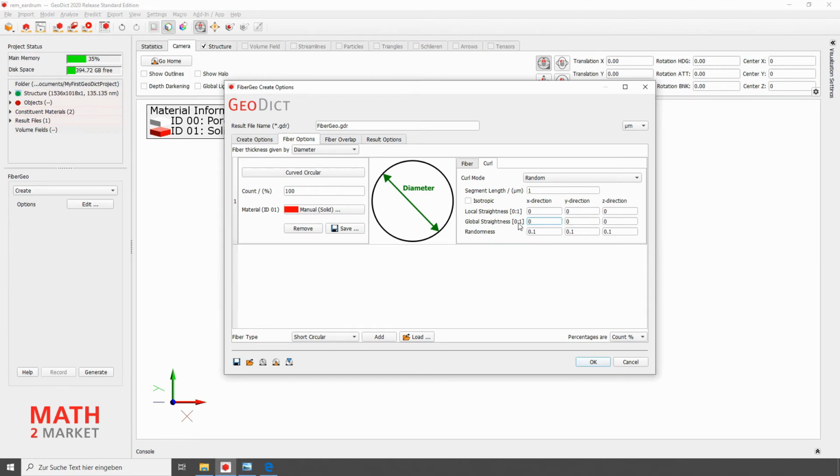Randomness determines how much random deviation may be added to the direction defined by the previous parameters in each segment. As a rule, not a value too high should be selected here, otherwise the parameters selected above will lose their meaning.